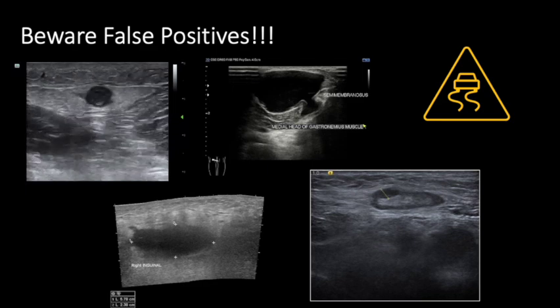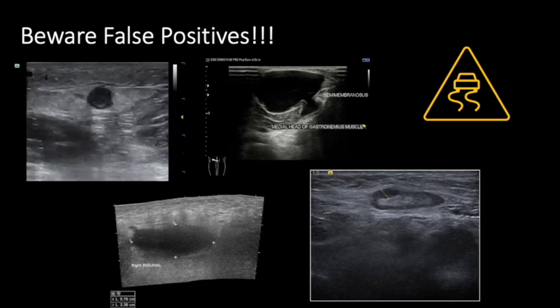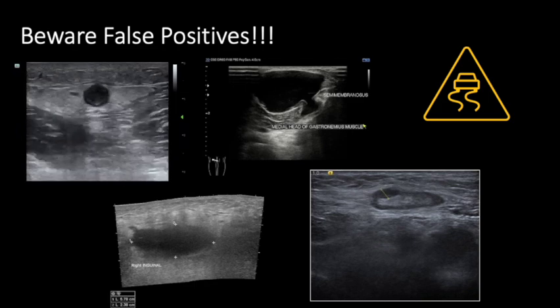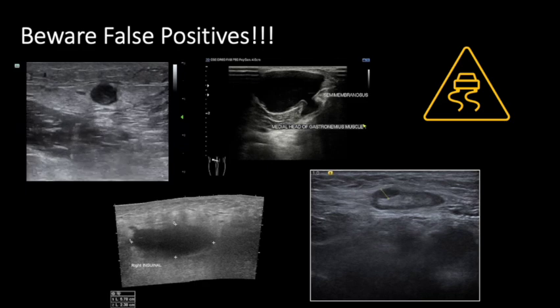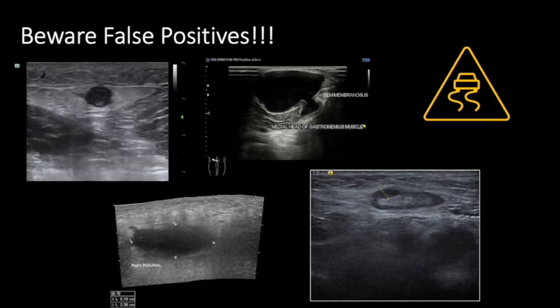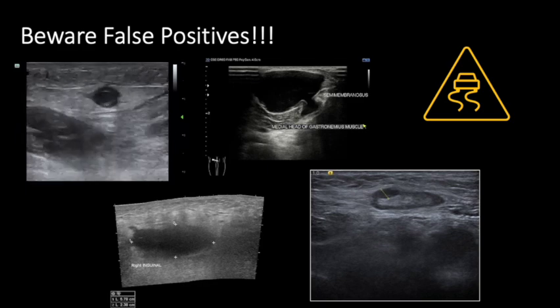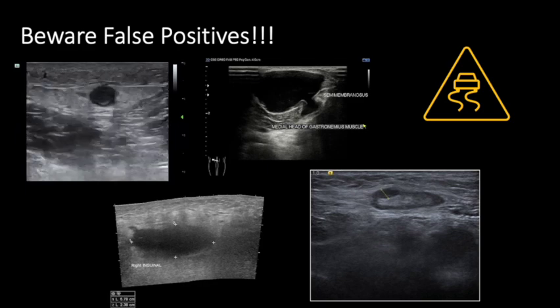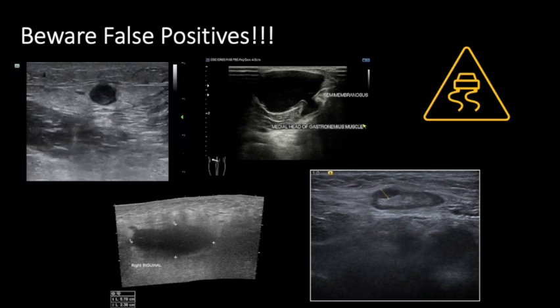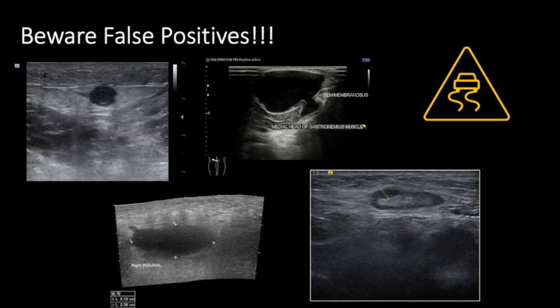Lastly, the bottom right picture shows a lymph node, with the typical architecture of a hypoechoic cortex and a hyper- or isoechoic hilum on the inside. Remember that lymphatic structures often run near vessels and can be mistaken for DVTs. However, following the extended compression ultrasound protocol discussed in this lecture should help you avoid being tripped up by these mimickers.